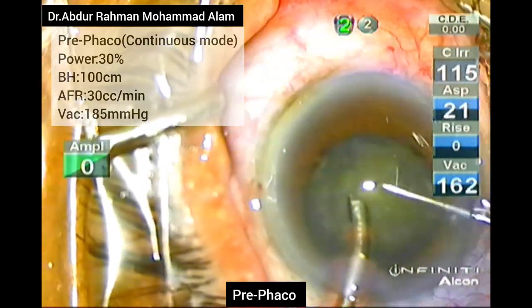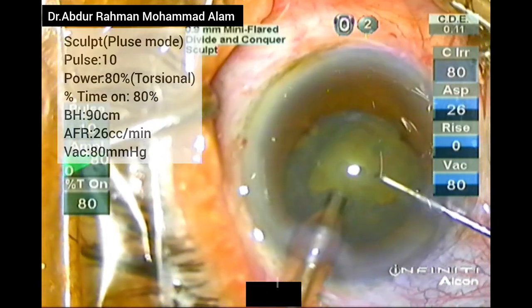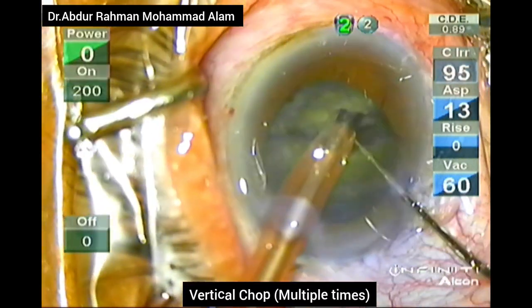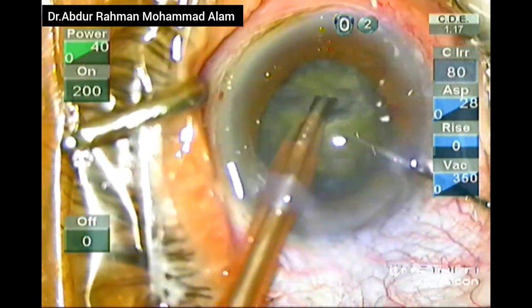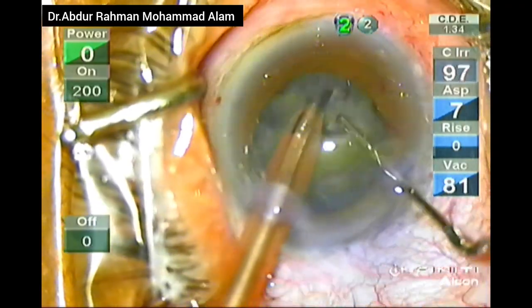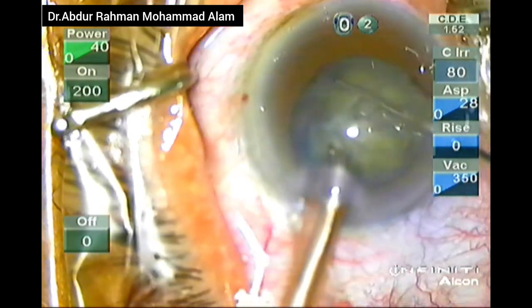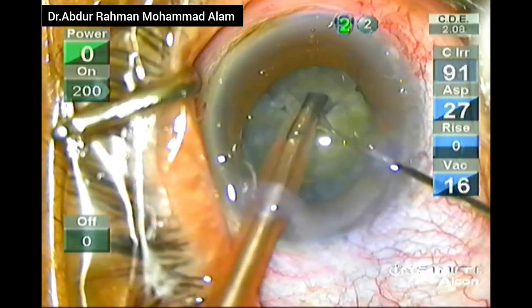The phaco settings that I am using are given in the upper left corner of the screen. I am performing a vertical chop with the help of a Sinskey hook. Now I am further chopping the hemi-nucleus into multiple small pieces. The pieces are being chopped successfully.